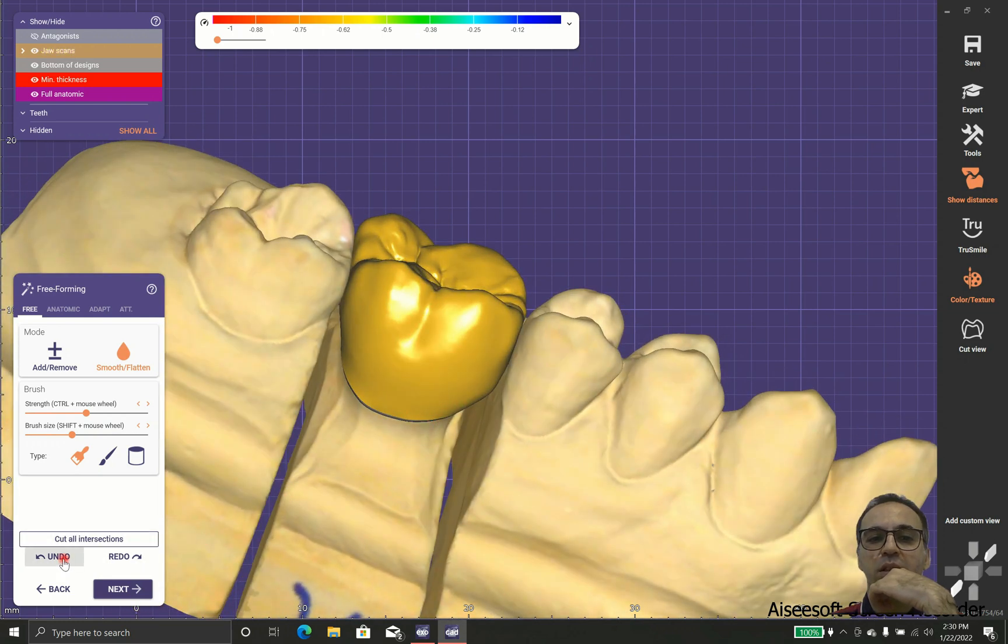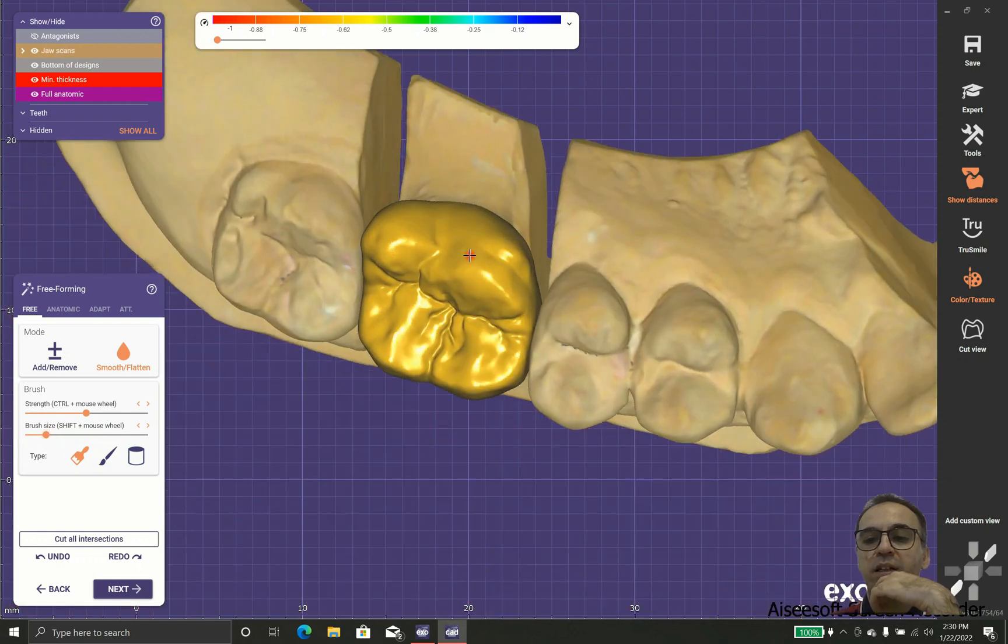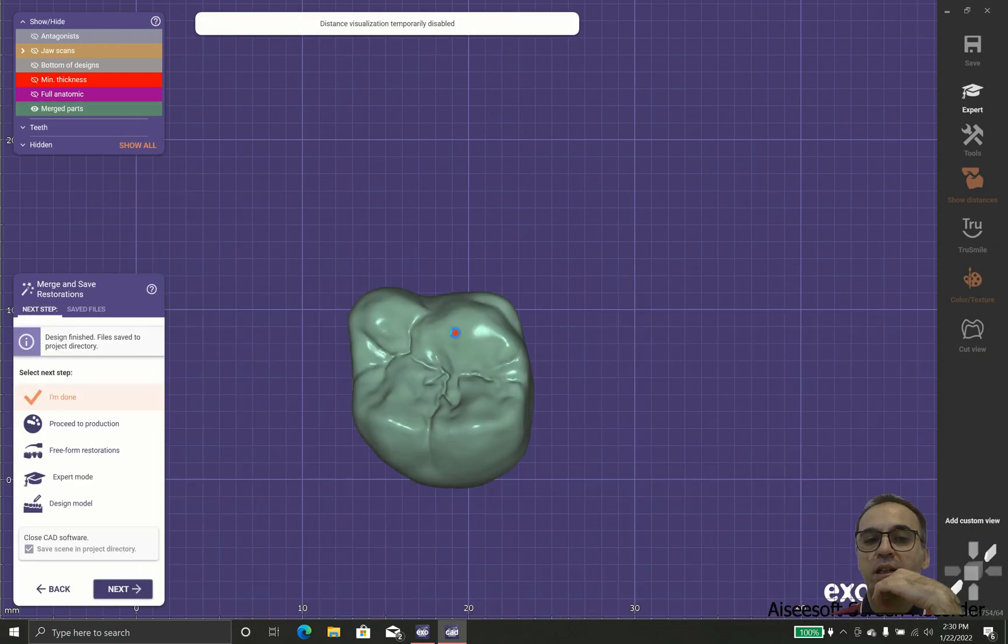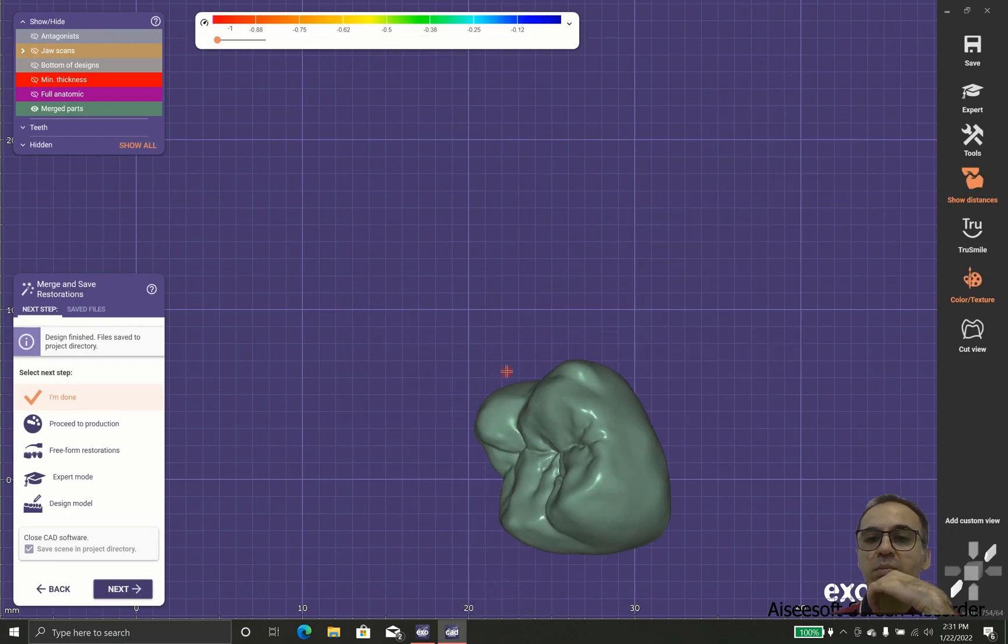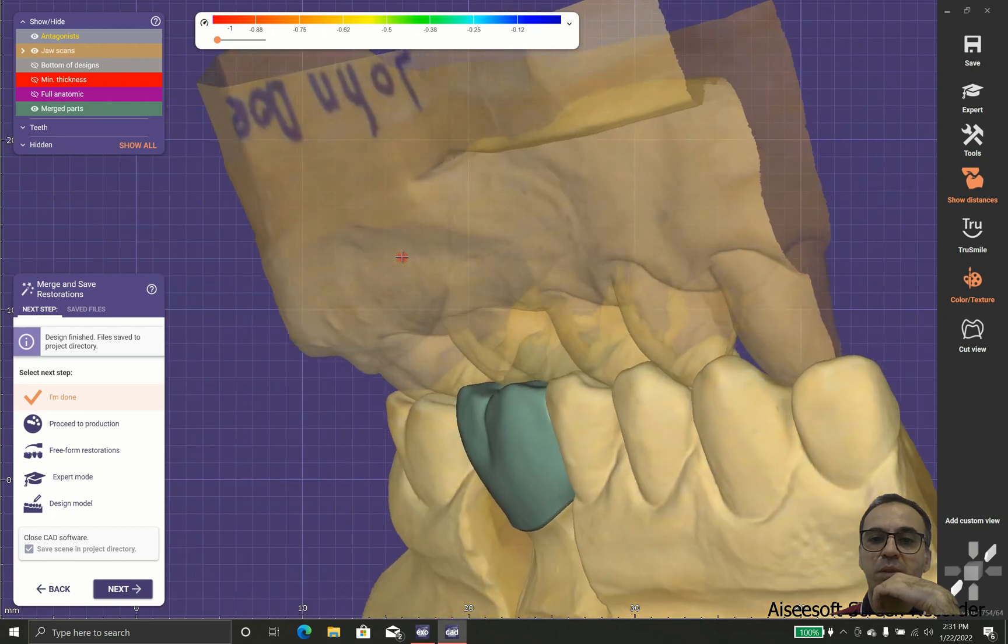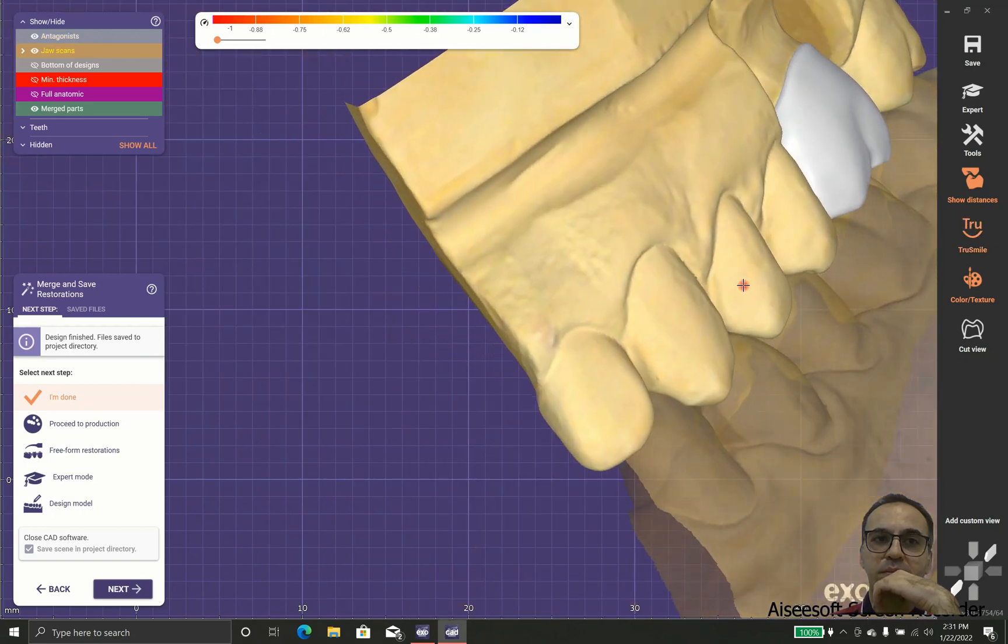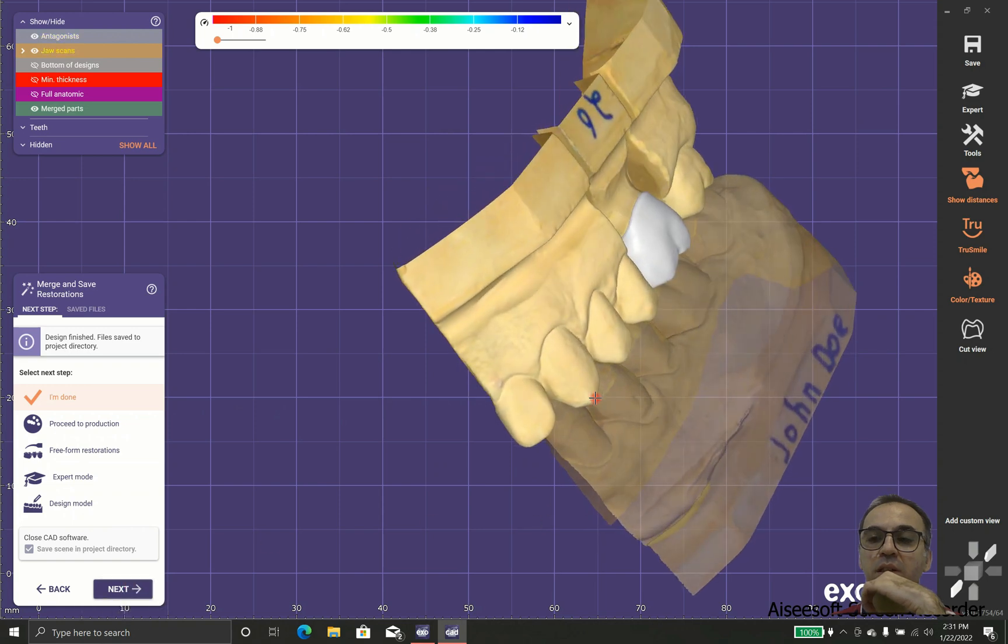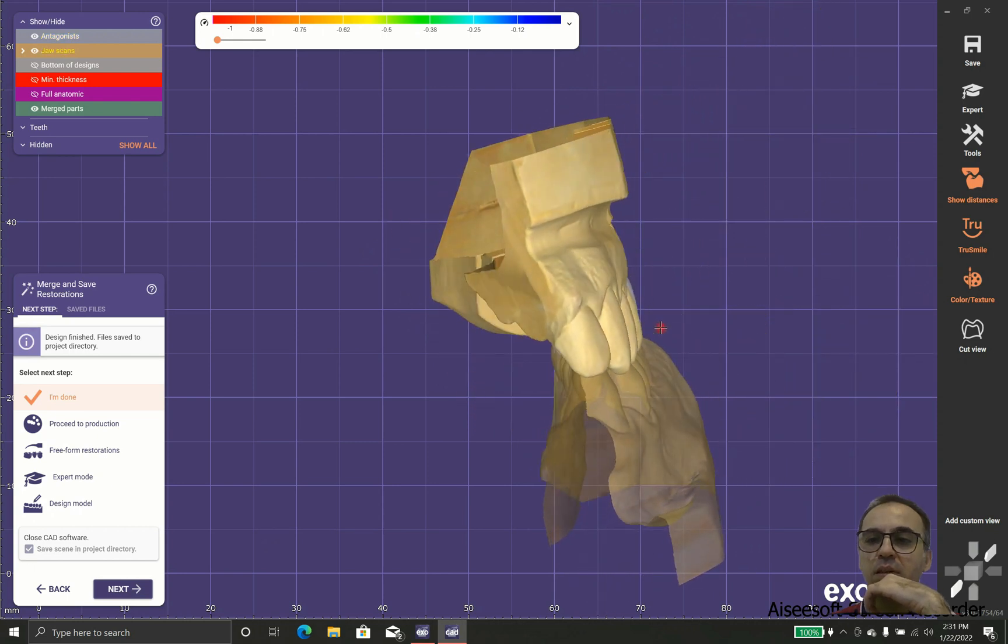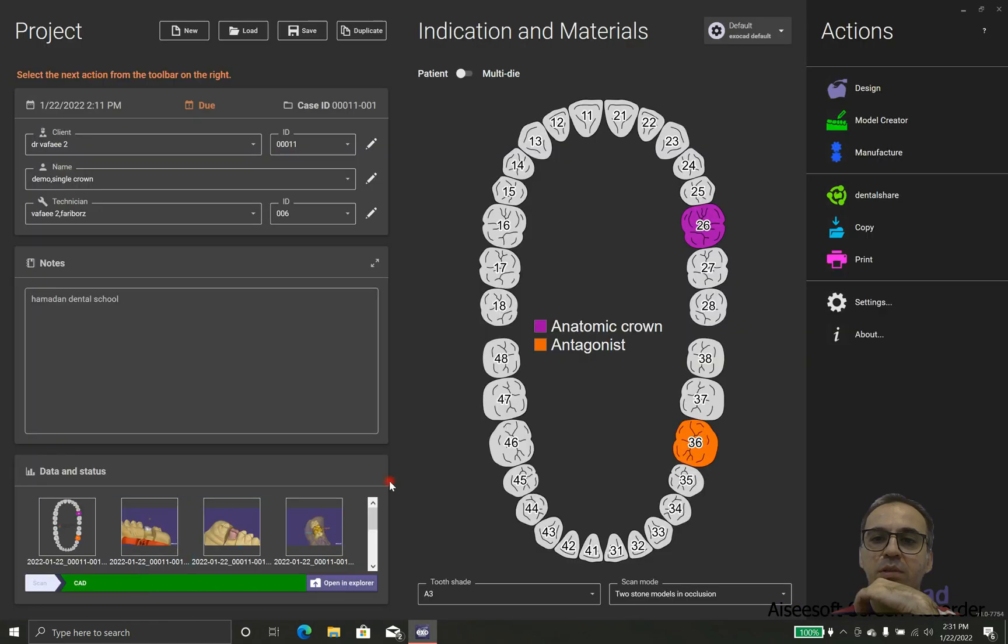Now when we are happy, we can proceed to the next step. In case that we have any final adjustments, it's better to be done here and not let it stay. When you are going to check the restoration mouth, the problem still stays and you have lots of problems adjusting with neighboring teeth and other teeth. Once we are done, it's better to check everything including neighboring teeth and opposing teeth. In case that we are happy with everything, we could proceed to production.